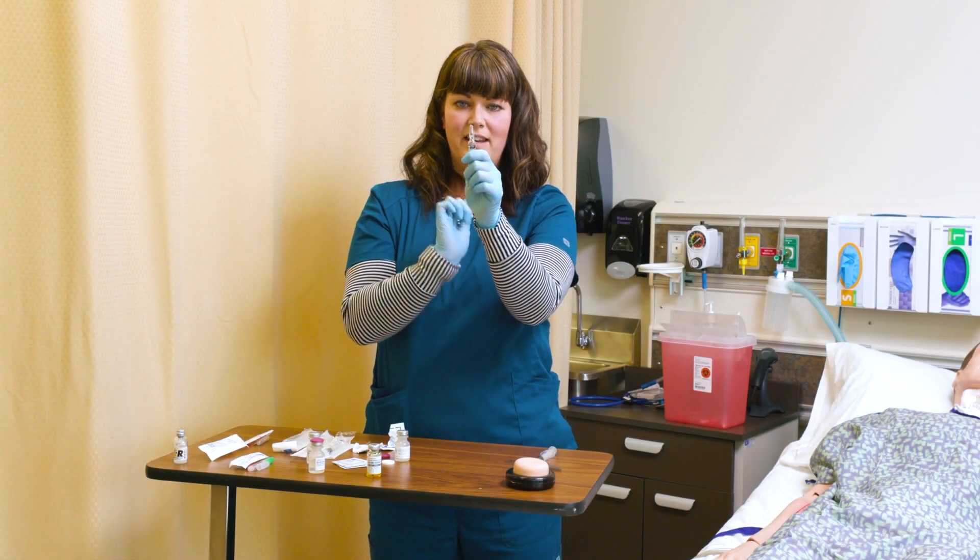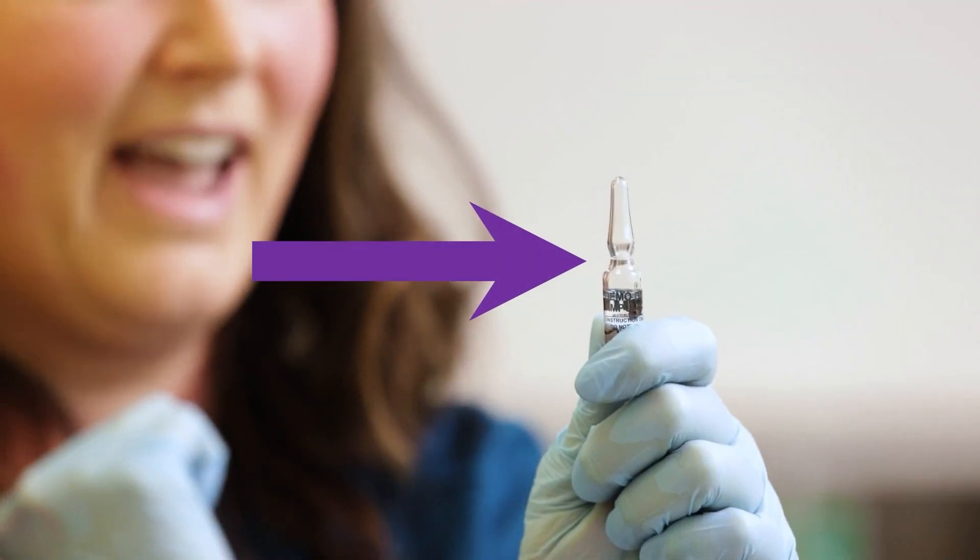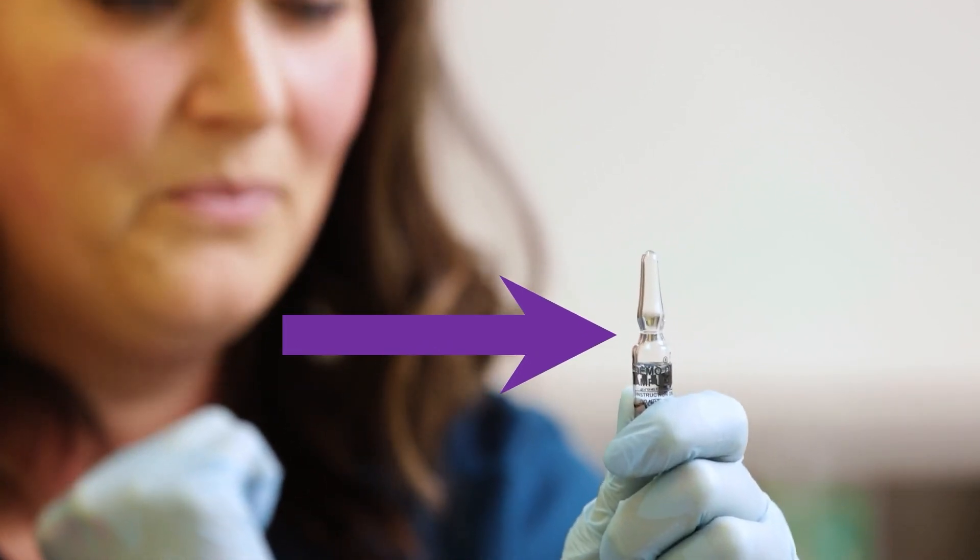The ampoule has a neck, and the neck is where it narrows in. You'll see a line around the neck — this is where it's meant to be broken.